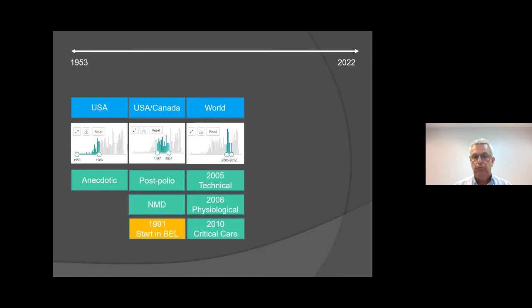And then until 2012, this experience spread around the world, and at that time we had more and more studies regarding technical aspects, physiological aspects, and also the use of the mouthpiece in critical care units.